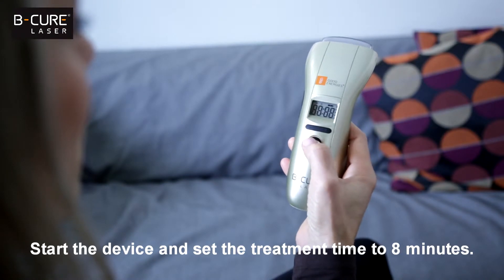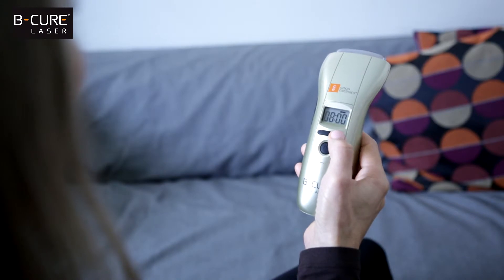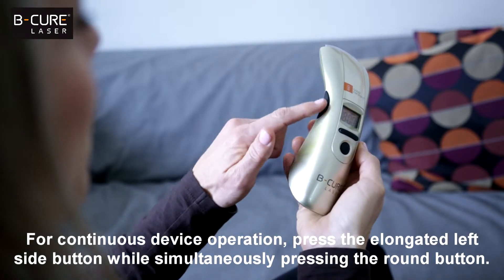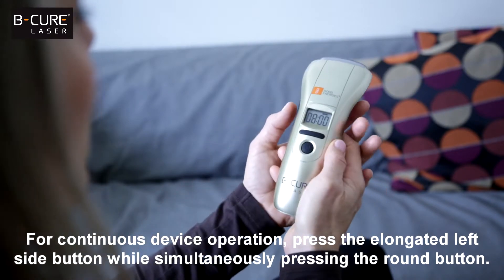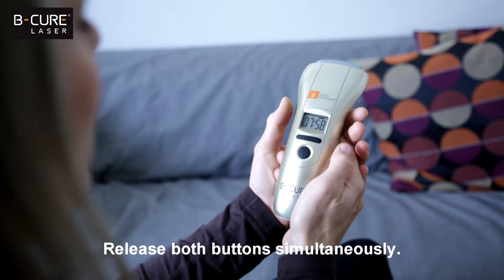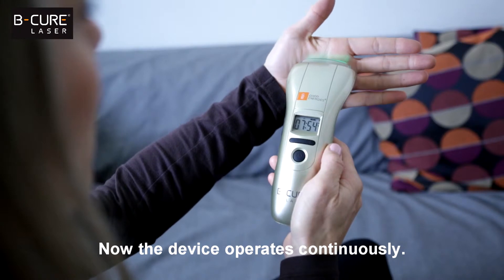Start the device and set the treatment time to eight minutes. For continuous device operation, press the elongated left side button while simultaneously pressing the round button. Release both buttons simultaneously. Now the device operates continuously.